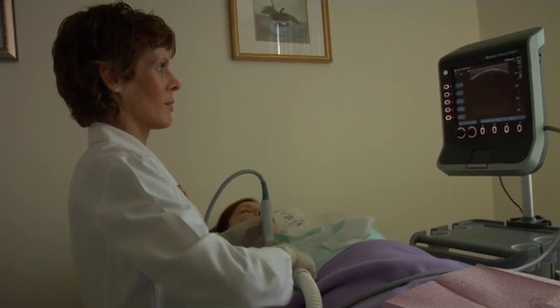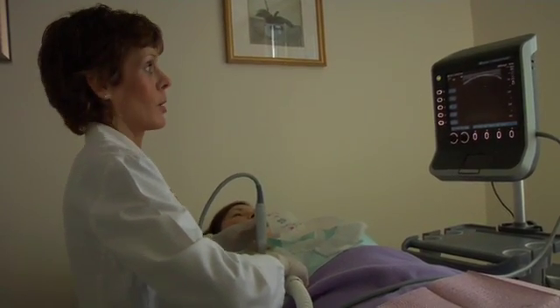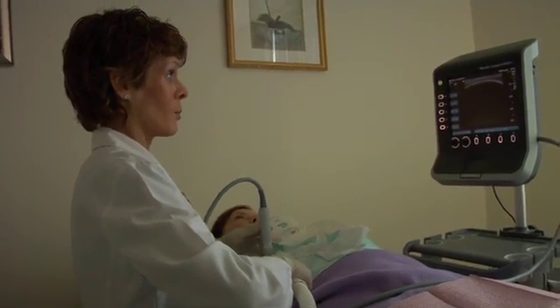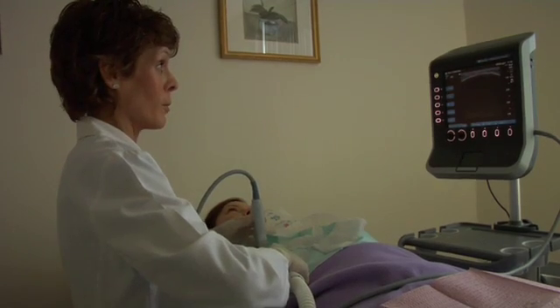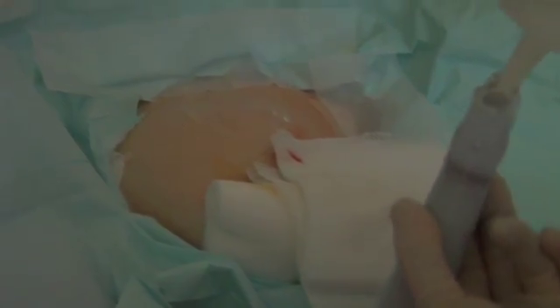The image quality is — you're not going to get much better than this, no matter how much you pay for the system or how much it weighs. When you consider you're getting this incredible image quality and the functionality, plus I can just pack this up and take it to the operating room, throw it in the trunk of my car — you don't get that with any other system. They've not just kept pace with everybody else, but really surpassed them.